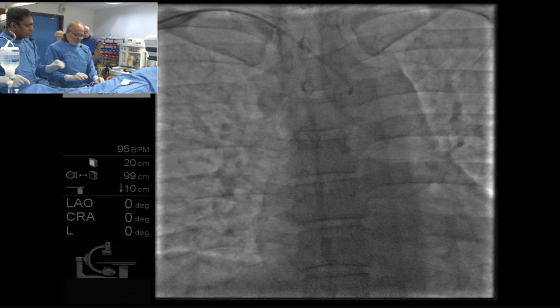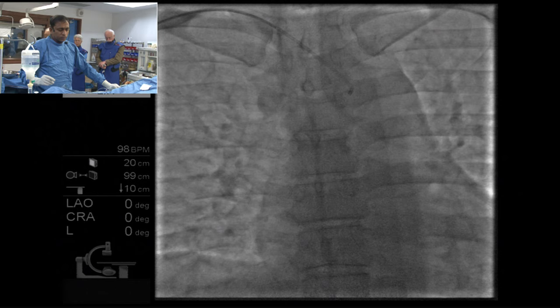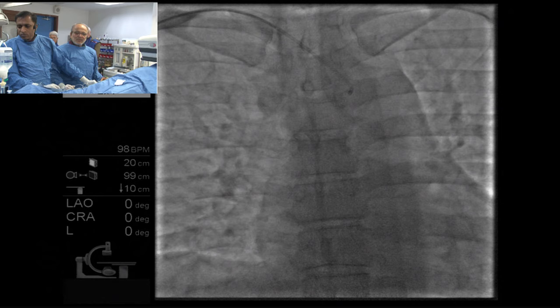It's a complex anatomy, and one has to be very, very patient. The only advantage I see working through arteria lusoria is once your guide catheter sits in the coronary, arteria lusoria adds extra backup to the guide. You can do anything, and the guide will not come out. Yep. It also eliminates the carotid from the innominate. That's right. You get protection probably.